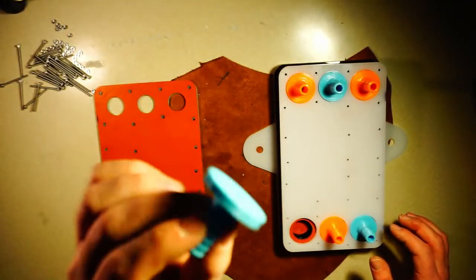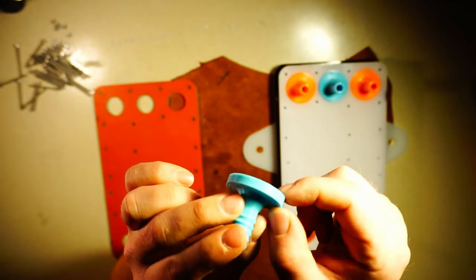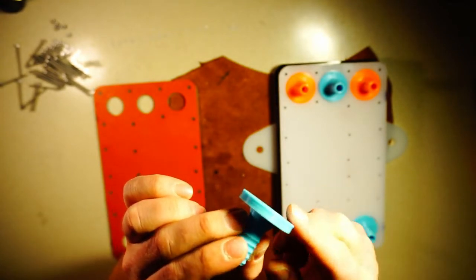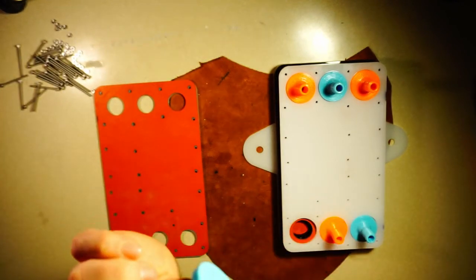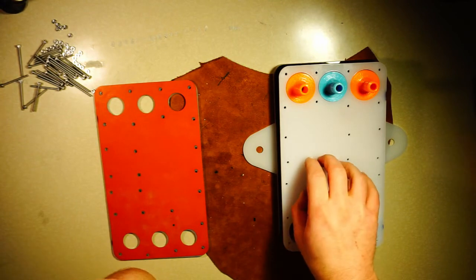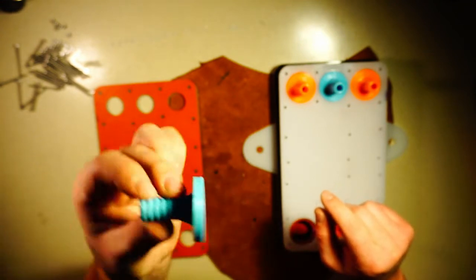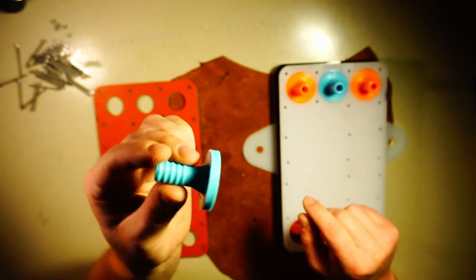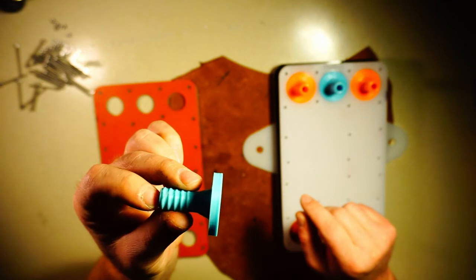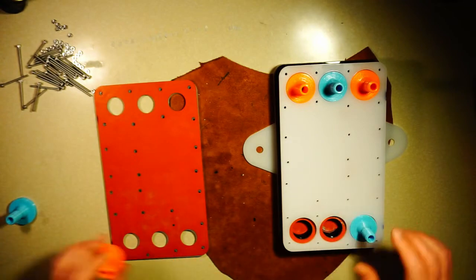One thing to note is that sometimes 3mm acrylic is 2.5mm or 3.2mm, and so in the source files, this thickness here is adjustable so that your ports can match the thickness of these plates and be solidly sealed within the valve block, but also not force them apart. So that's one number that can be adjusted in the 3D printer files, or these could also be cut from a piece of nylon hose fitting or injection molded in a production situation. So I'm going to take these ports out.